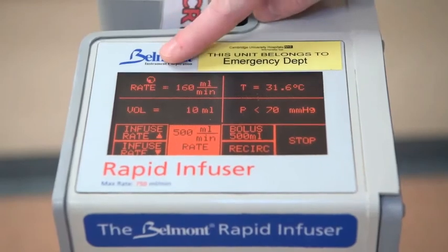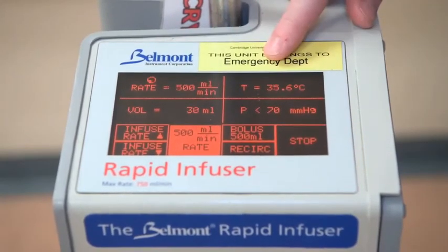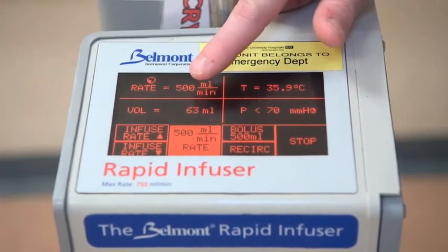You'll see at the top of the screen it's telling you the rate that it's delivering, the temperature that it's warming up to, the pressure that it's detecting, and also the volume that has been infused so far.